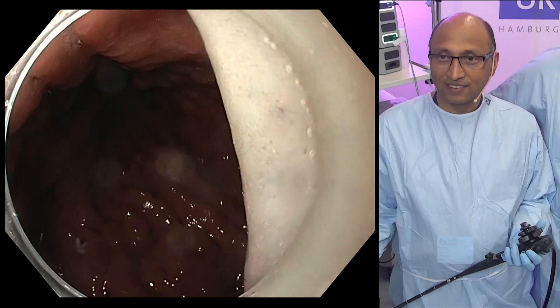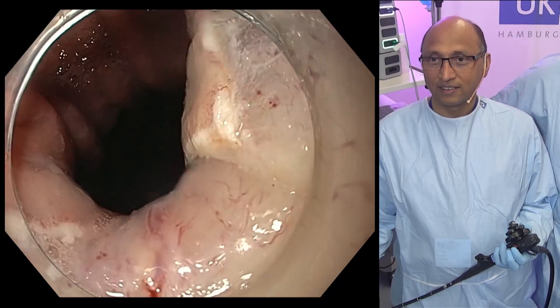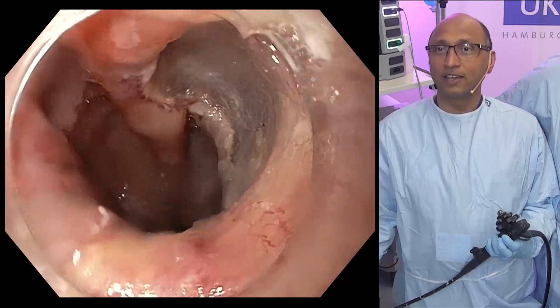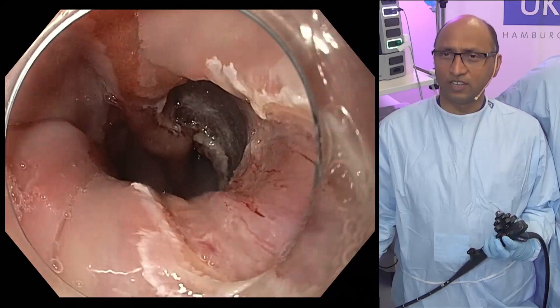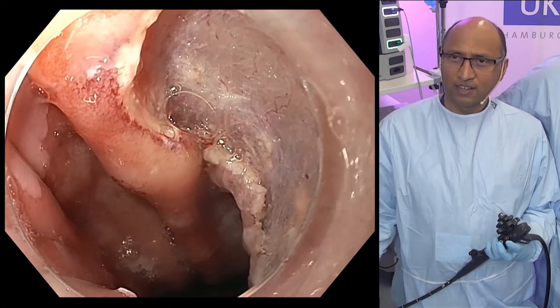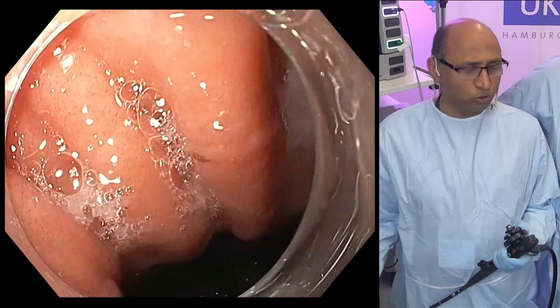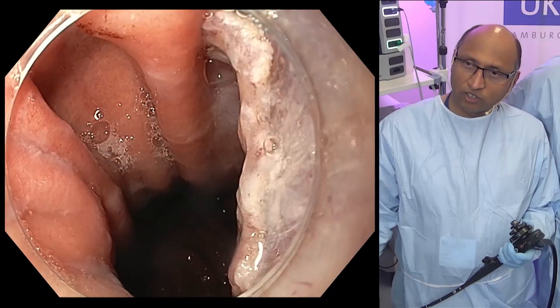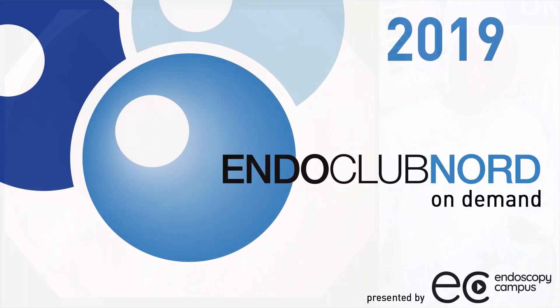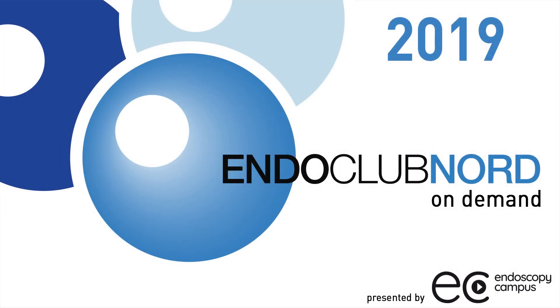Pradip did a great job. He completed the resection with five pieces. It looks like he did an ESD but it was definitely a piecemeal EMR. You can see very wide excision, and that's one of the reasons why EMR outcomes are so good — it took about 12 to 15 minutes to do such a wide field excision.